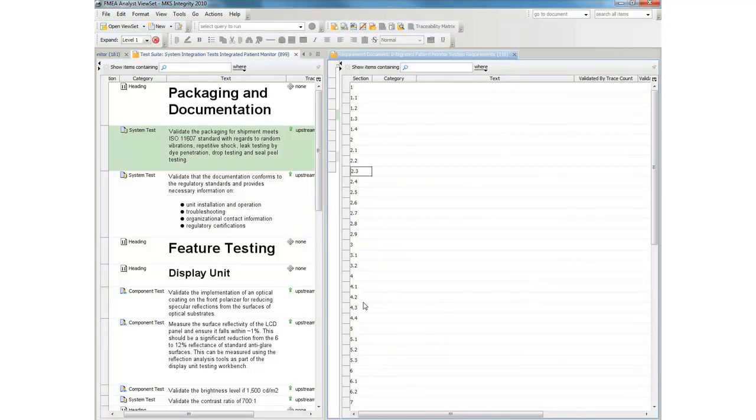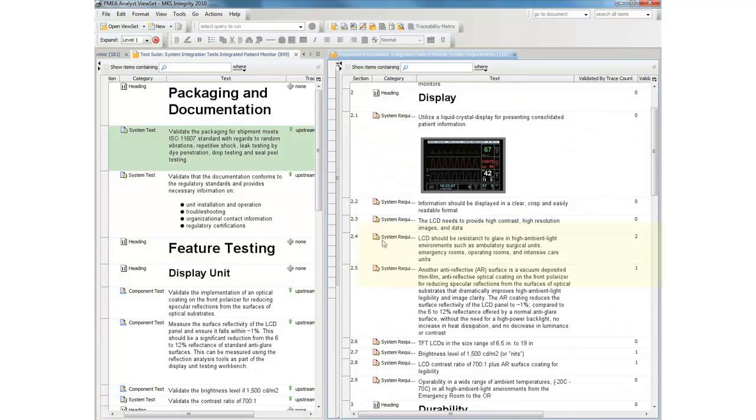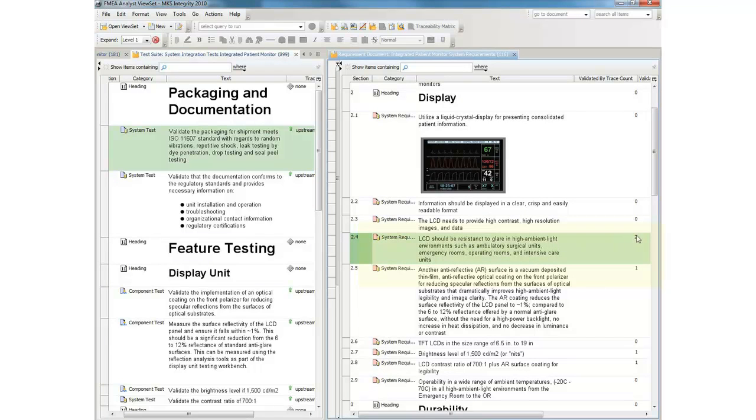Note that the trace count of the requirement automatically increments and the requirement is flagged with a downstream trace when we establish the linkage from the new test case.